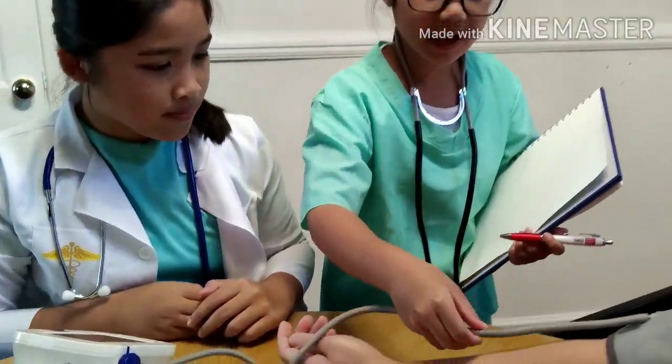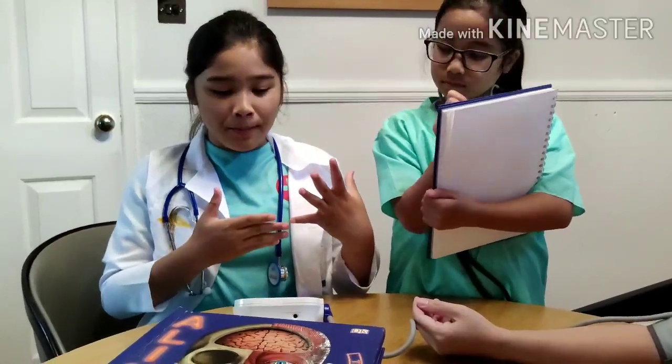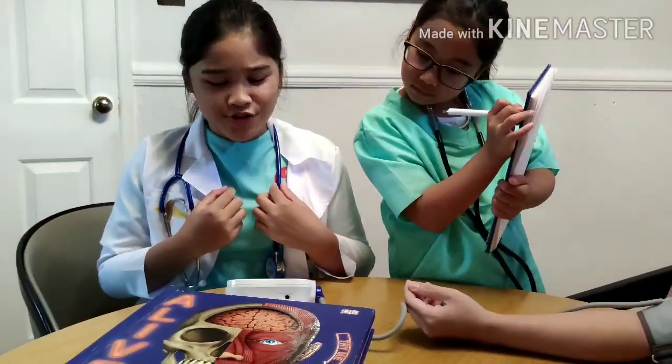The two fingers should be on the line of the arm, like this. When taking your blood pressure, don't talk and just relax.